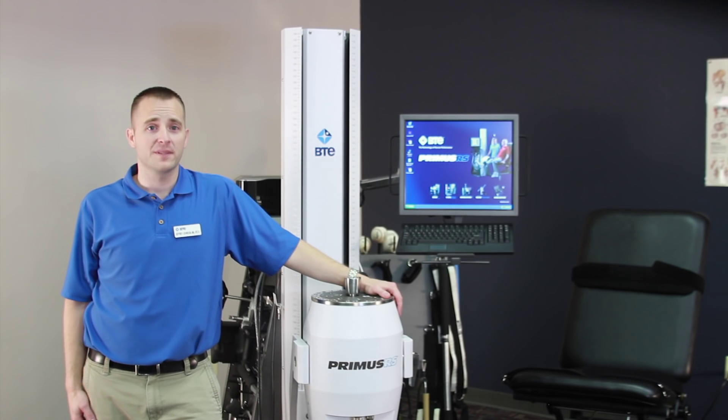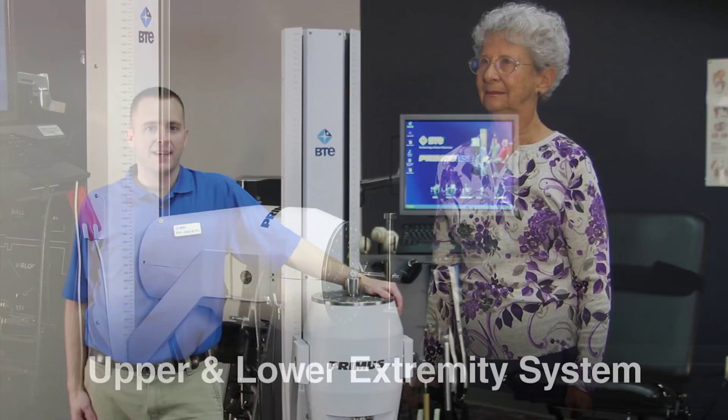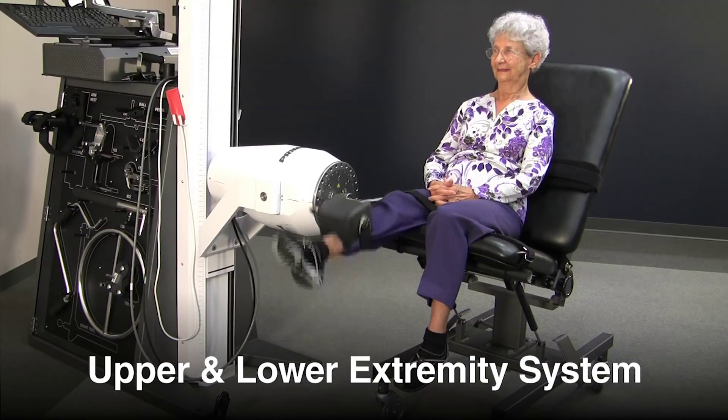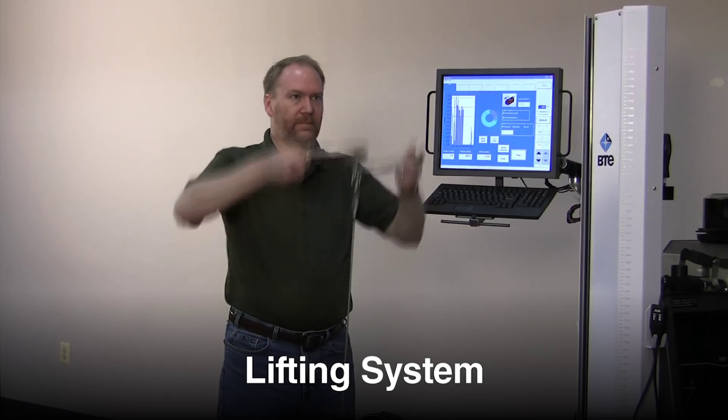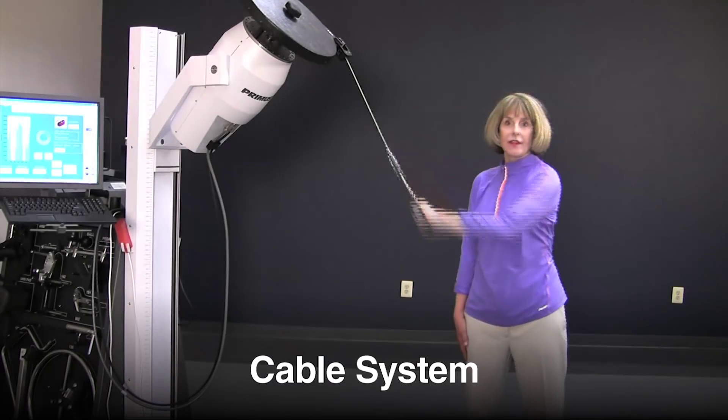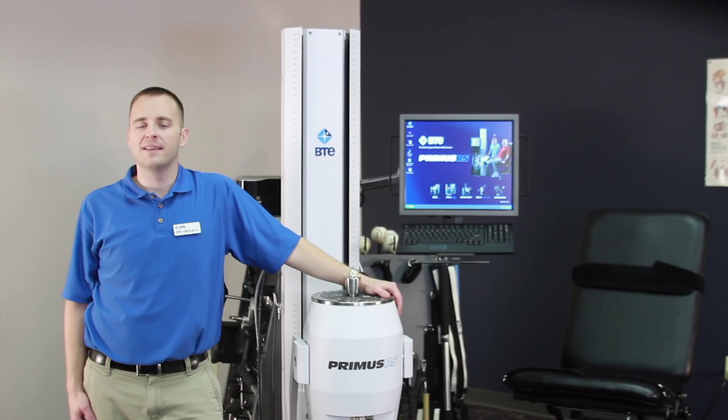Primus gives you four platforms all in one smart system, integrating an upper and lower extremity system, a task simulator, a lifting system, and a cable system. Primus can be shared equally between occupational and physical therapists. Primus saves floor space, giving you the flexibility to treat a variety of therapeutic needs, all in less than the footprint of a single treadmill.